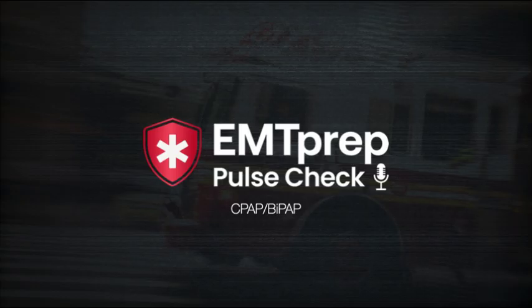Question number 10. What is one of the major benefits of early CPAP and BiPAP use in respiratory distress patients? A. There is no benefit of early intervention. B. It can prevent the patient from having to be intubated and on a ventilator. C. It resolves all signs of respiratory distress. Or D. It can prevent the patient from becoming septic.